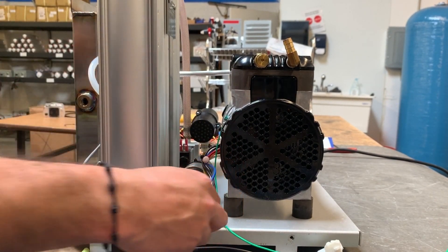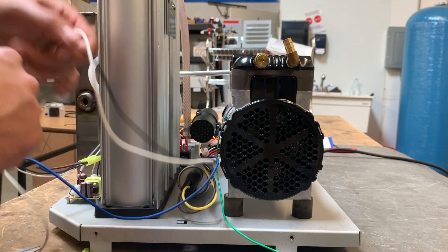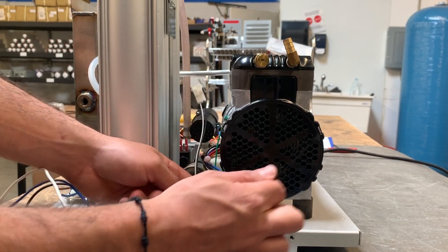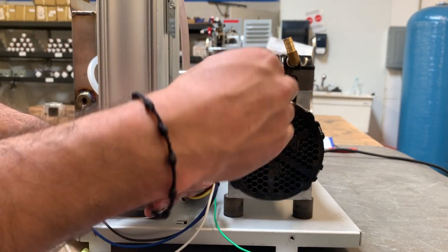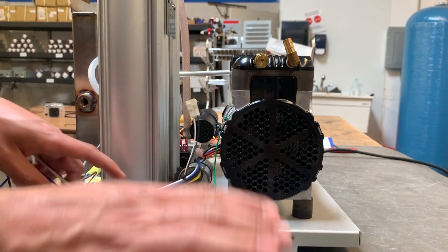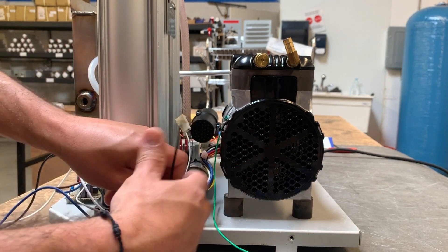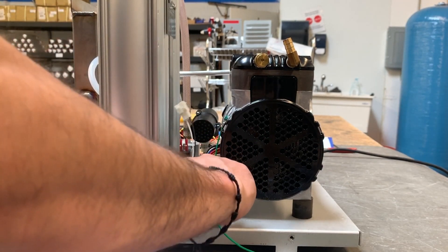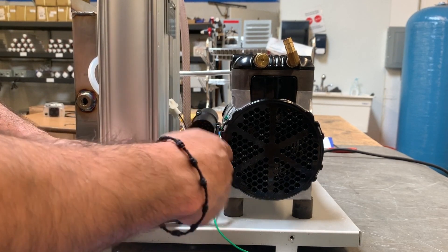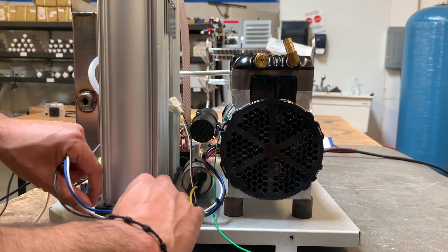Run the rest of the wires — grab your fan wire and put it over the slot. Measure everything and keep them nice and tight. Leave a small loop, insert it in the slot, tie it down, and continue to run your wires.